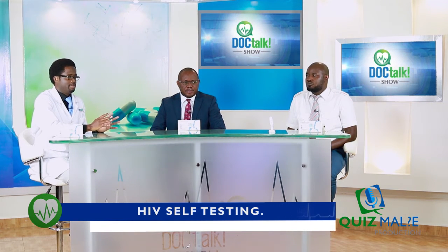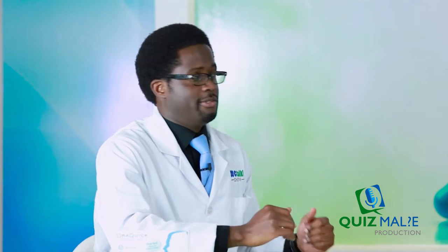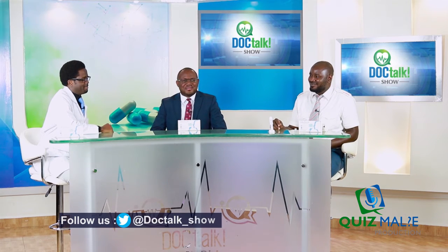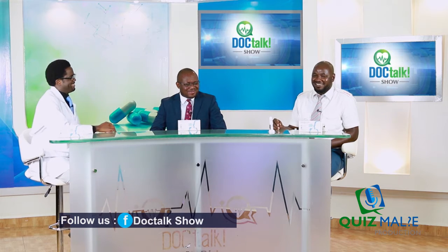It's a diagnostic error. The test kit was wrong, so you have to repeat the test. So, Mr. Victor, back to you. We have just tested you, and now you have to go through the horrors of interpreting your result.